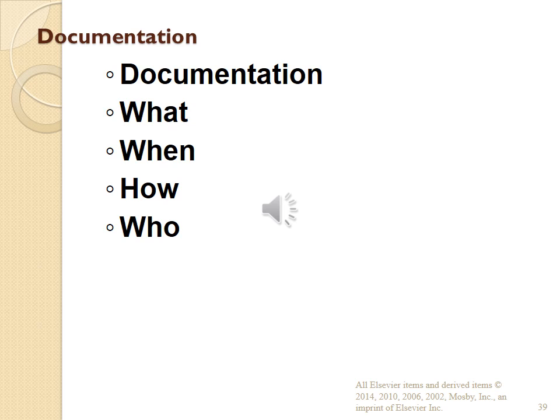Documentation. What, when, how, who. Computerized charting. Not charted, not done. Clear and complete documentation. Fetal heart rate assessment must be documented. Institutional policies for strip notation. Most institutions require a printed strip posted and it's scanned into the computerized EMR system.